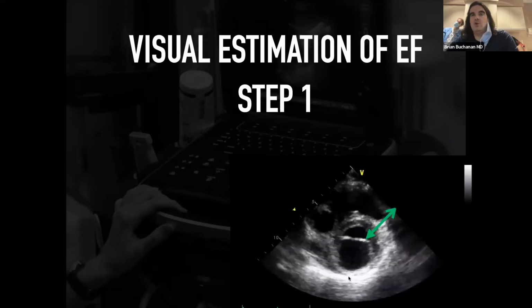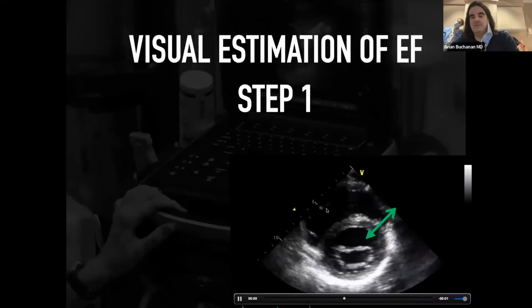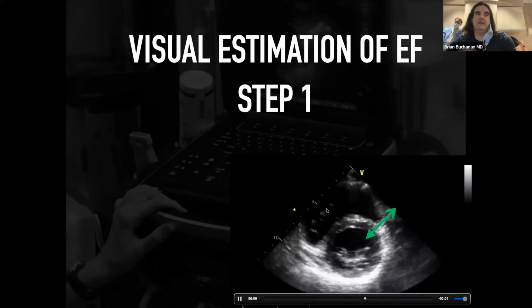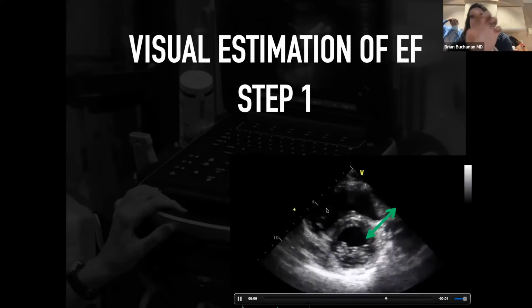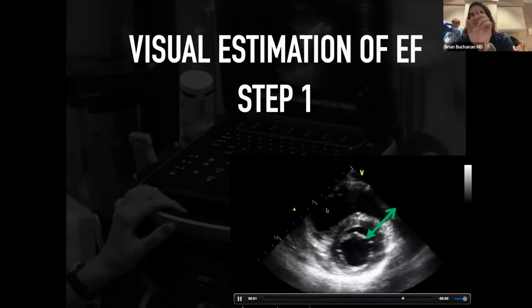So this is the short axis level from the parasternal view. Okay, we're at the level of the mitral valve, and we're looking just at thickening of the LV. You notice here that we see the LV all the way around. The LV cavity should be circular. If it's egg-shaped, then it's going to be off-axis.